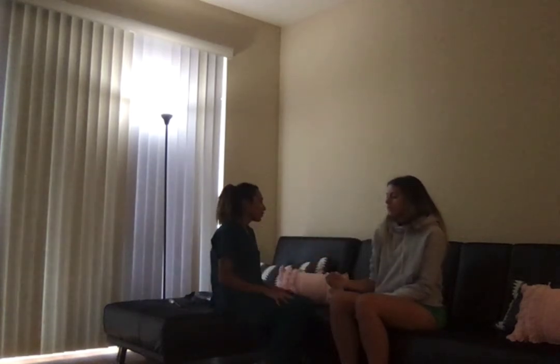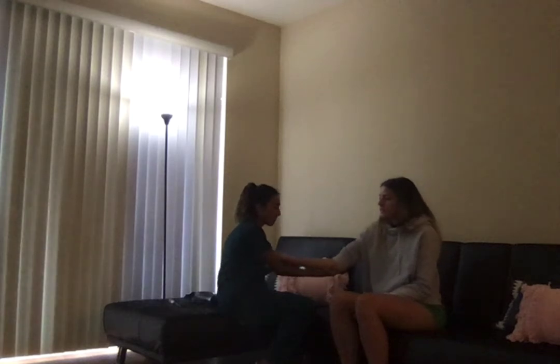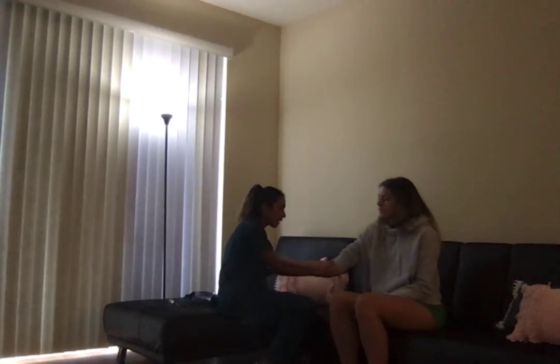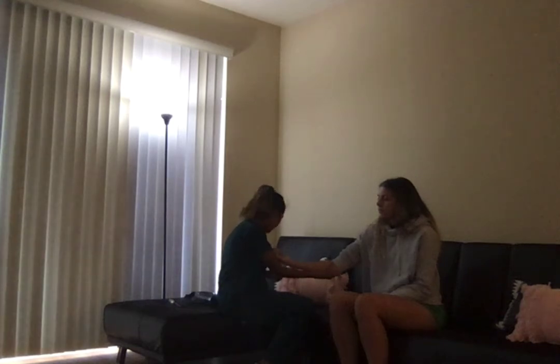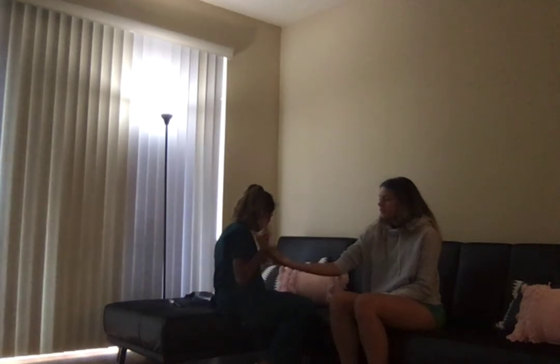And then I will do the biceps tendon reflex, so I'll take my patient's arm in my own, and I will place my thumb over the crease of the elbow, and I will strike my thumb with the pointy side of the reflex hammer, and the normal finding is that the muscle will flex, which it does, so that's great.